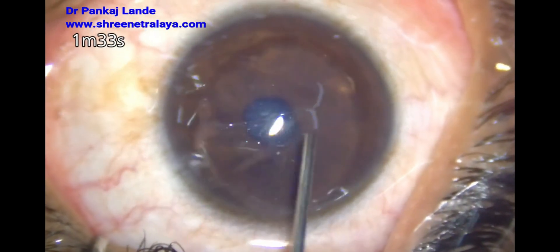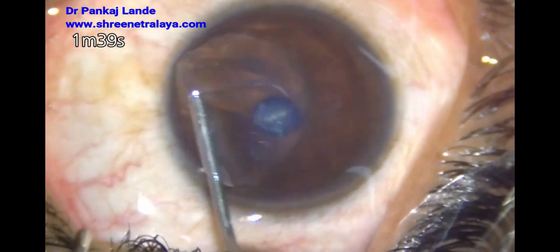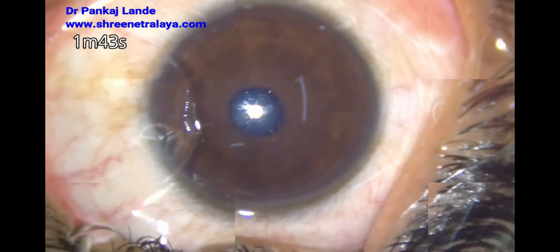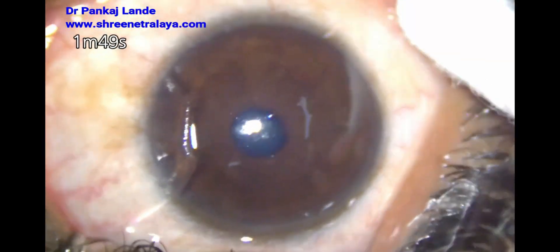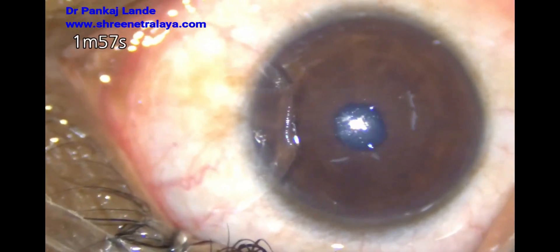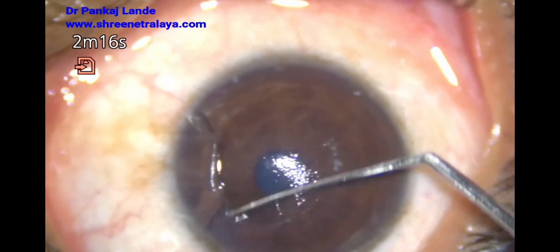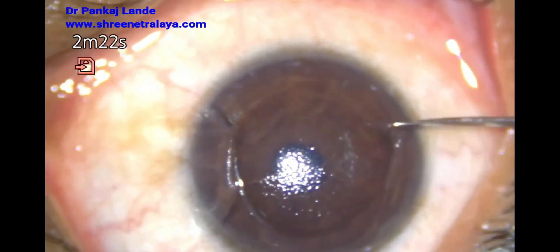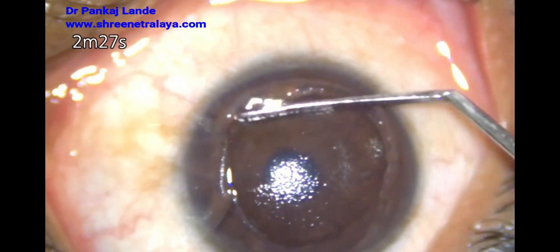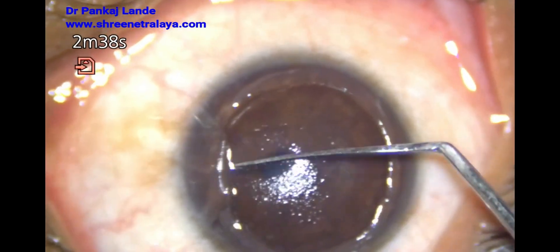You can see the flap is totally folded and dislodged from its location. The flap looks slightly edematous, the hinge is very small, and there is epithelium growing inside the ablation area. This area has to be cleaned very carefully as this can cause epithelial ingrowth. You can use low-concentration mitomycin or betadine to clean this area.